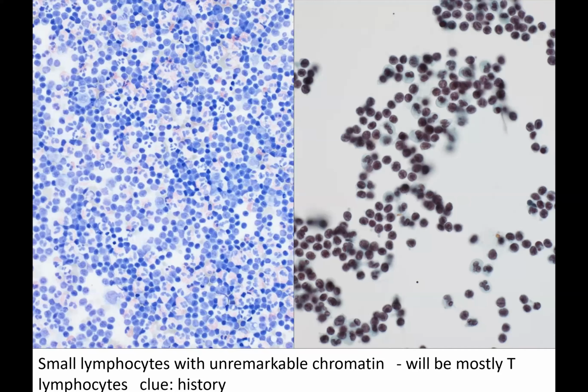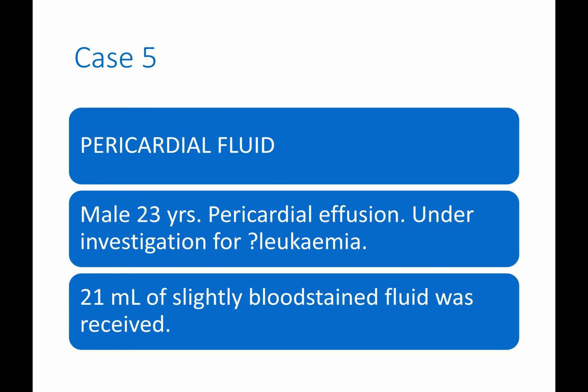Here we have a typical lymphocytic effusion with small, regular, unremarkable lymphocytes. They'll mostly be T cells on immunocytochemistry in a reactive effusion. And it's interesting, this one has also numerous eosinophils, and it's interesting to see how difficult they are to spot on the ThinPrep PAP preparation.